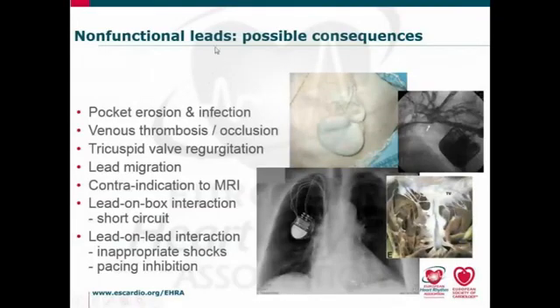Now, there is a risk of these non-functional leads having possible consequences, such as, in very thin patients, erosion of the pocket. You may have thrombosis, the more material you have in there, even though, quite honestly, there's not much evidence that the more leads you have, the more risk of thrombosis.